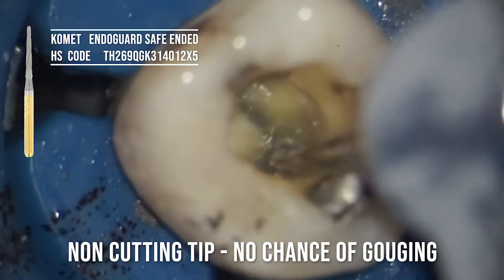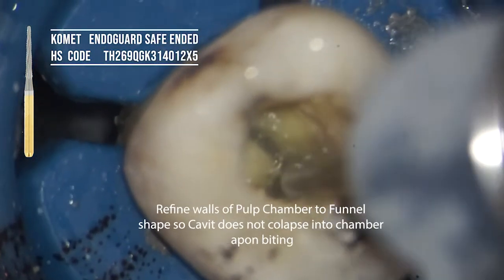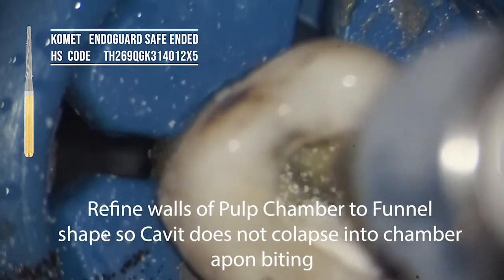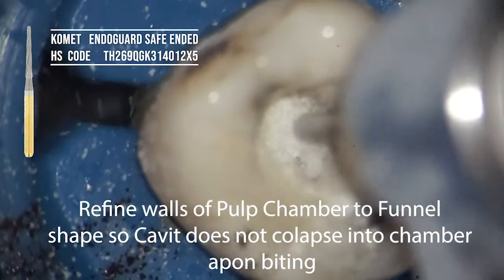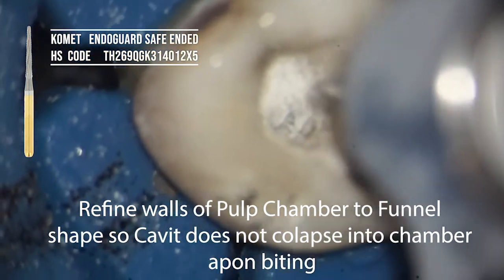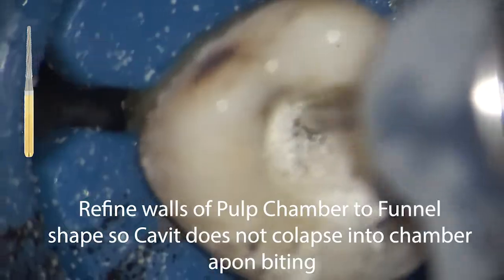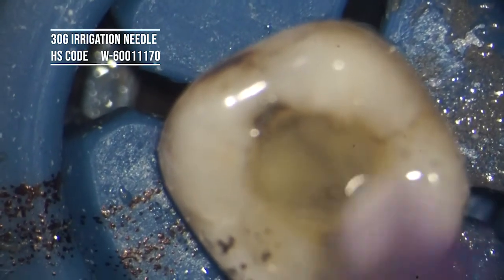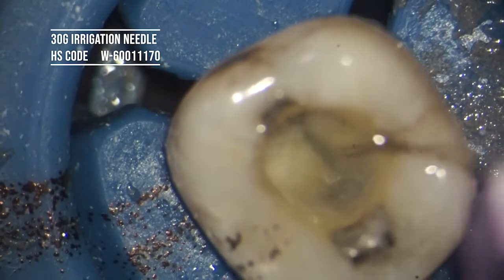And what I'm doing here is just removing and refining the pulp chamber walls to a funnel form, so that whatever temporization you put in here, Cavit or something else, it's not just going to collapse into the pulp chamber because you have a funnel form. Irrigating with a 30 gauge needle, always use a 30 gauge needle. And there we have our access prep.